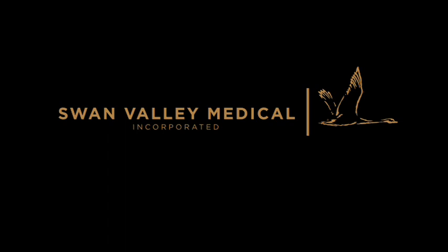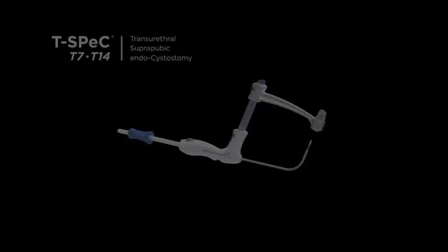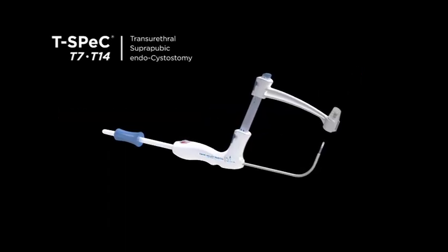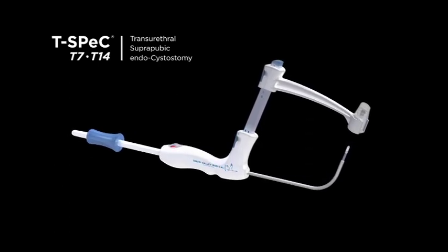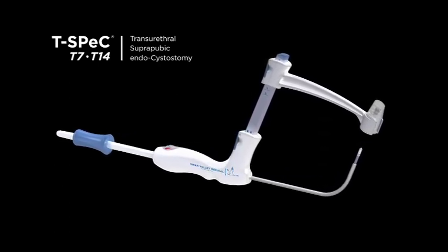Swan Valley Medical — innovative medical instruments for improved safety and quality of life. The T-Spec instrument precisely places an 18 French suprapubic catheter utilizing the proven transurethral route.